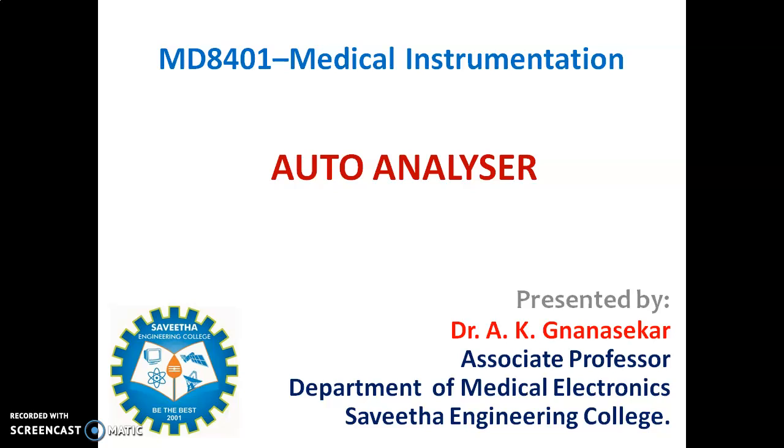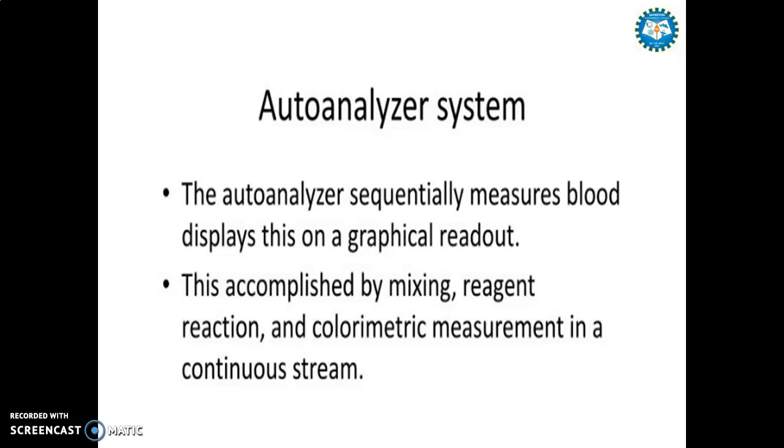Today I am going to discuss the topic Auto Analyzer. An auto analyzer system sequentially measures blood and displays the result on a graphical readout. This is accomplished by mixing, reagent reaction, and colorimetric measurement in a continuous stream.